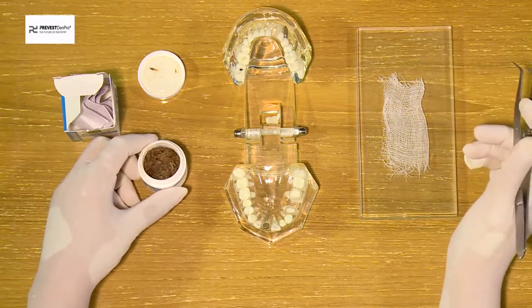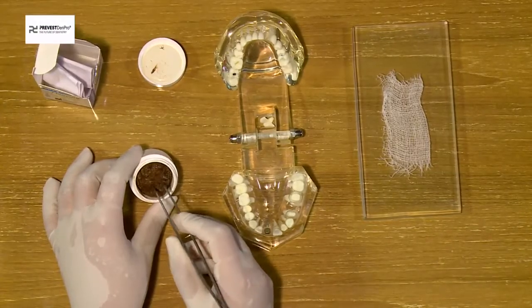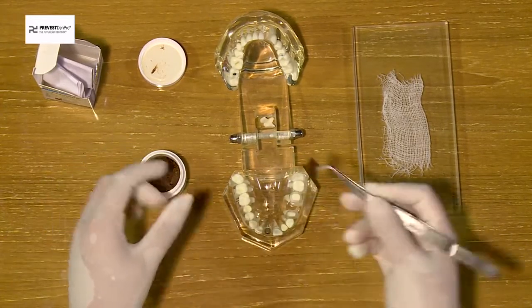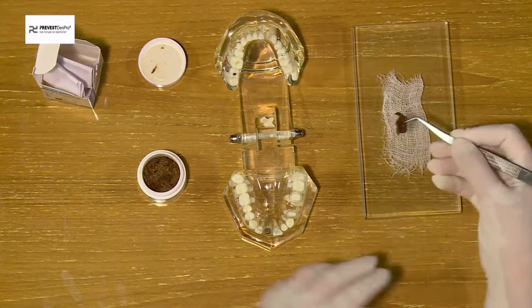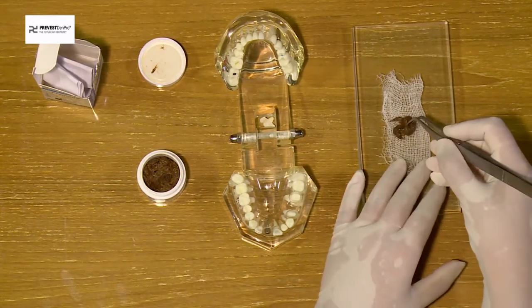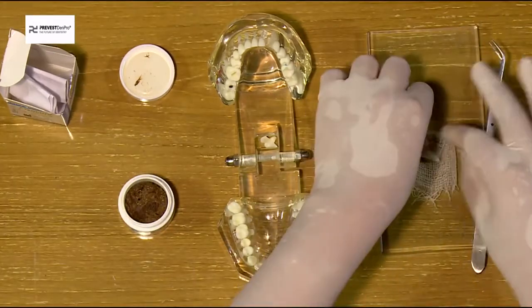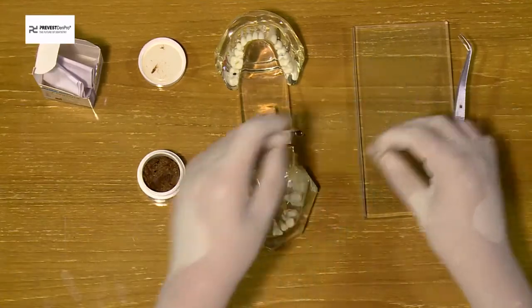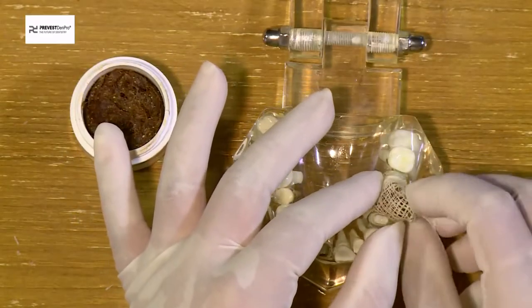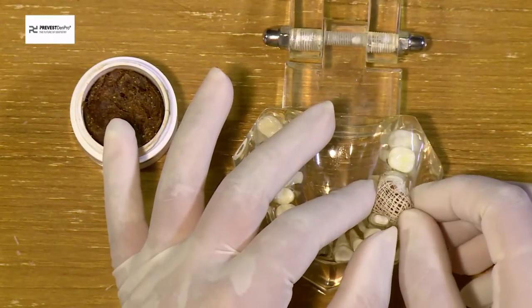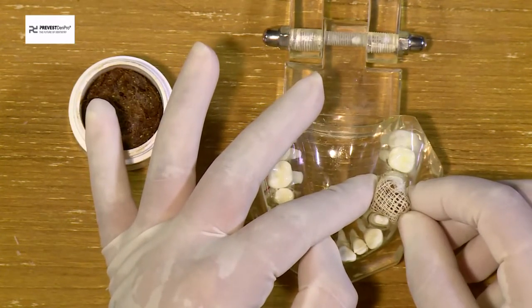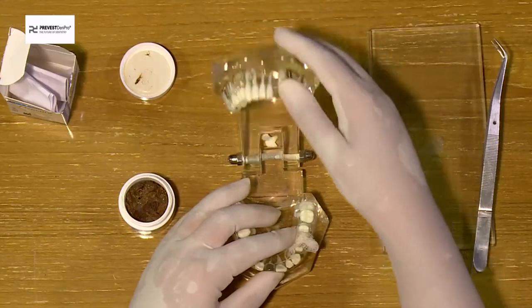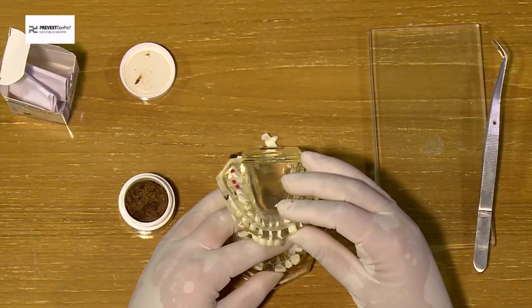It has two methods of application. First, the medicament can be directly applied over the socket. In the second method, the medicament is placed on a gauze piece. The gauze piece is folded and placed over the socket, using enough to cover the exposed surgical site. The patient is then allowed to close the mouth and hold the gauze piece in place.